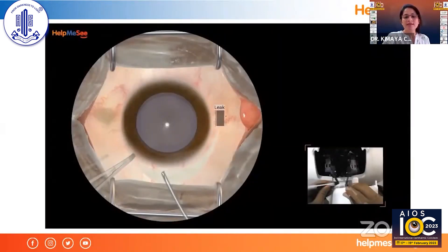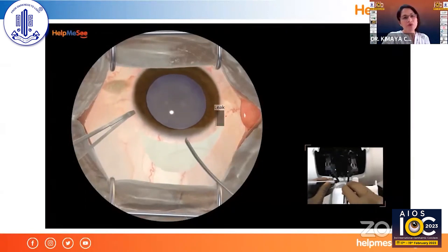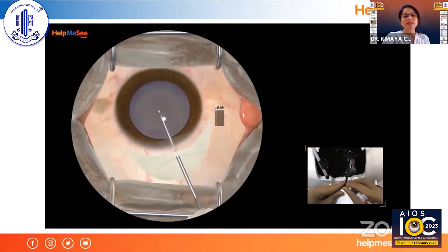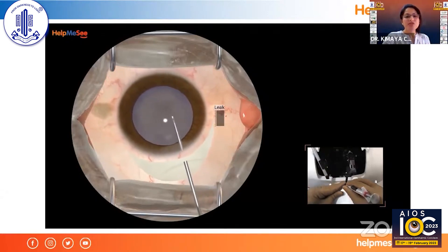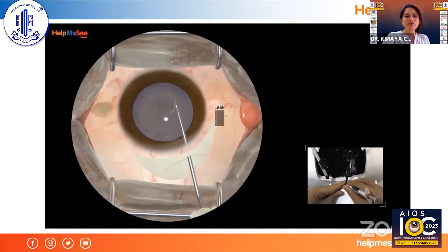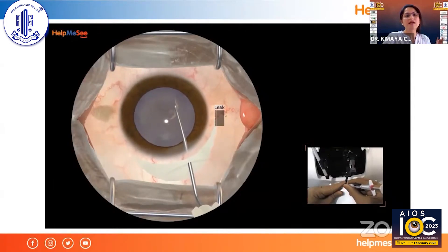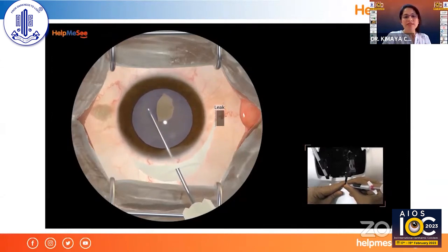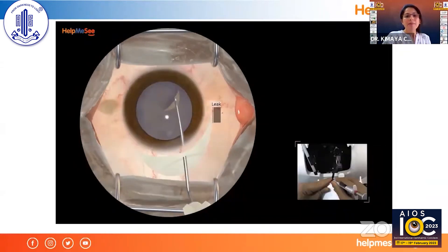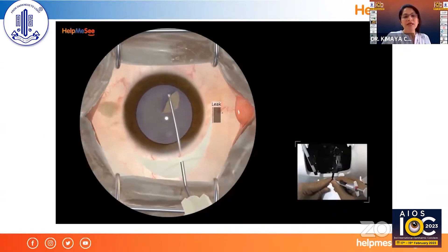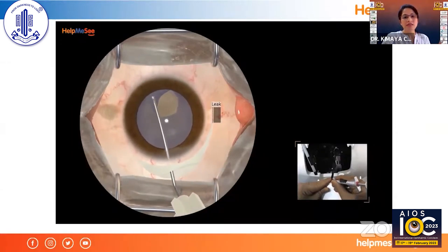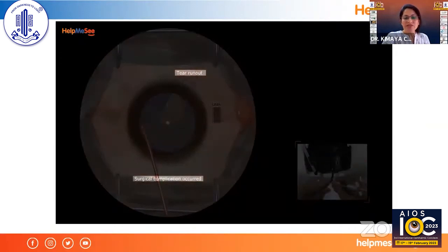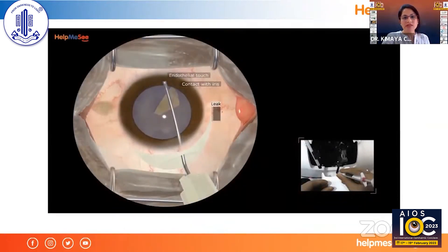For the capsulorhexis, I've chosen the cystotome as the instrument — we also have utrata on the simulator. I'm going inside making a C-shaped and reverse C-shaped incision, and the feel of the capsule is almost exactly the same as in real surgery. If a complication like a capsule tear occurs, it is shown on screen and the instruments turn red, so you go back and re-attempt.